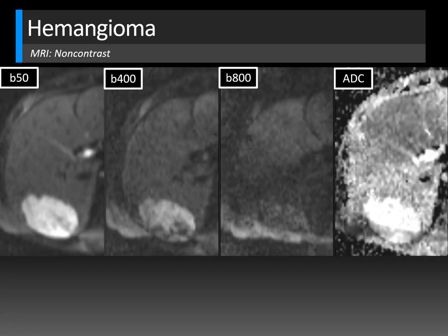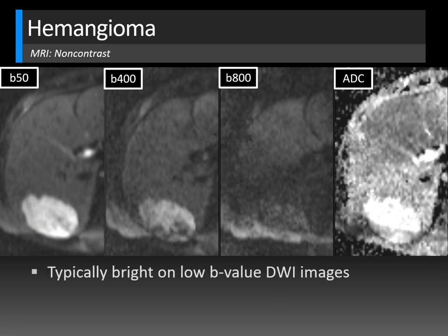On diffusion weighted imaging, a typical abdominal MRI diffusion sequence includes B50, B400, and B800 series. As the B value increases, the strength of diffusion increases but the signal-to-noise ratio decreases, making higher B-value images fuzzier. Also, as B value increases, the strength of T2 weighting decreases. So lesions that are T2 bright — like hemangiomas — will be bright on B50 but become dark on B800. CSF and other fluid-containing structures that do not restrict diffusion will also become dark on B800.